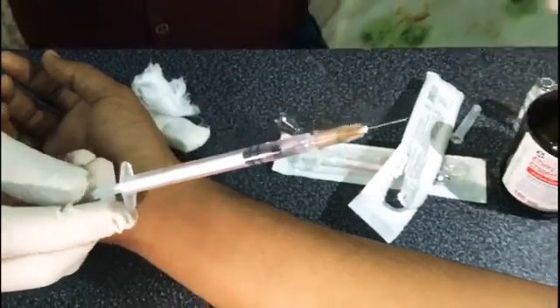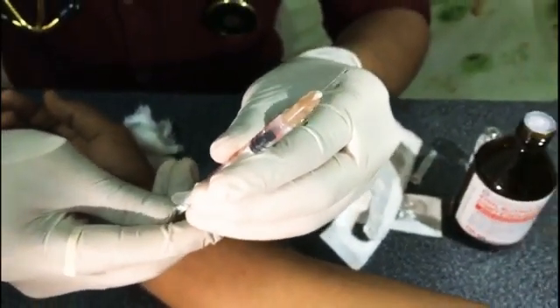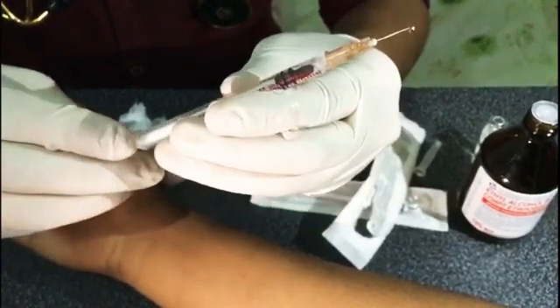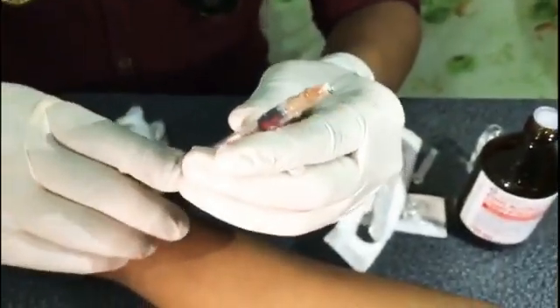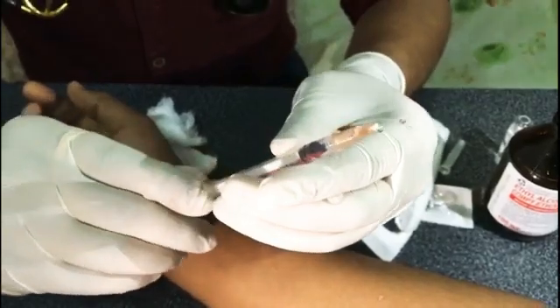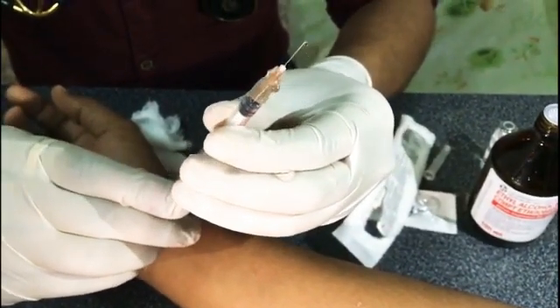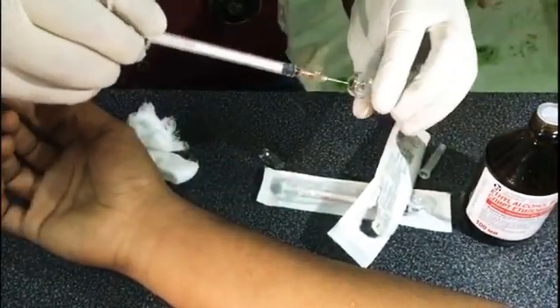Take the minimum quantity of the injection and check whether there are any air bubbles inside. If everything is perfect, reload the injection and get ready to give the intradermal injection.